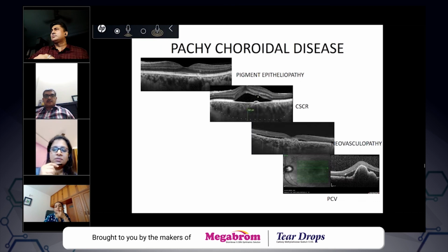Sir, what is the role of angiogram in uveitic patients? What particular uveitis cases would you take up for angiogram? See, definitely we will do angiogram in posterior uveitis, especially the common one, VKH. These patients we will do angiogram. Traditional teaching is that VKH is seen in bilateral middle-aged ladies, but we see a lot of VKH cases in young patients. We see unilateral cases.